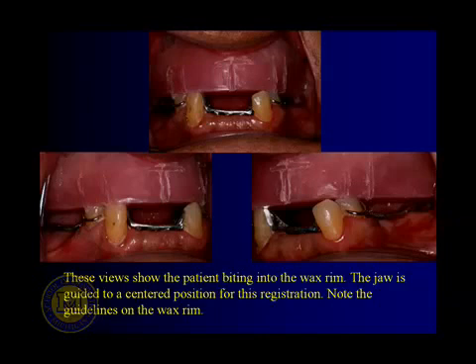The wax is touching too quick and their teeth are already in contact with the wax rim, but their lips ain't together yet. Make sense? So what do we do? We cut more wax away until they can come down to where they moisten their lips, open, come together.